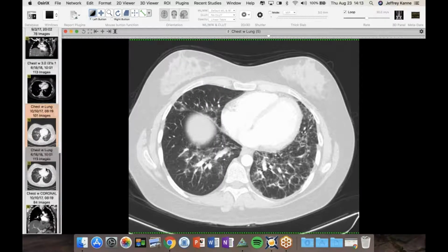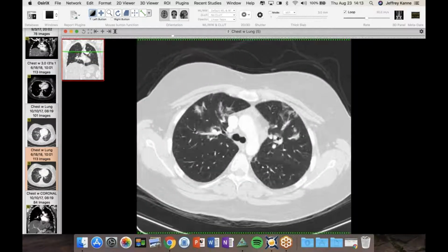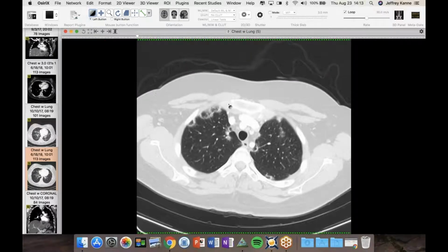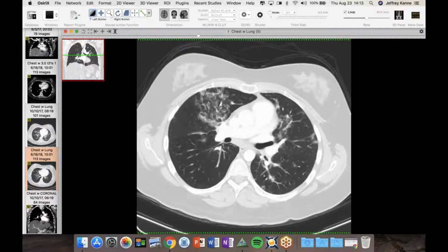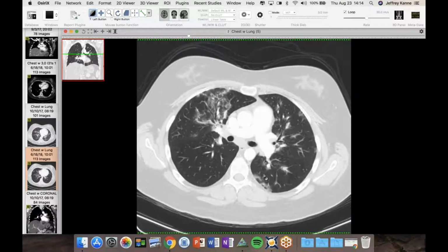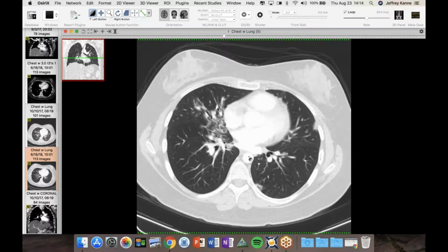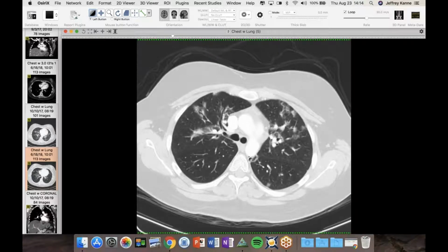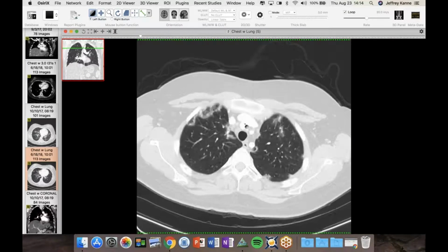But the reason I'm showing it is really her most recent scan. It's just one of the prettiest scans I've seen of atoll signs. You can see them here. So it's an archipelago of atolls. We've got these three right here. What's interesting about her is they never really identified a cause. So she was on steroids, and when they tapered her, she recurred with this appearance. So a very different appearance, but still very consistent with an organizing pneumonia. But I thought for the people learning out there that for an atoll sign, these are some of the better ones I've seen, also sometimes referred to as the reversed halo.